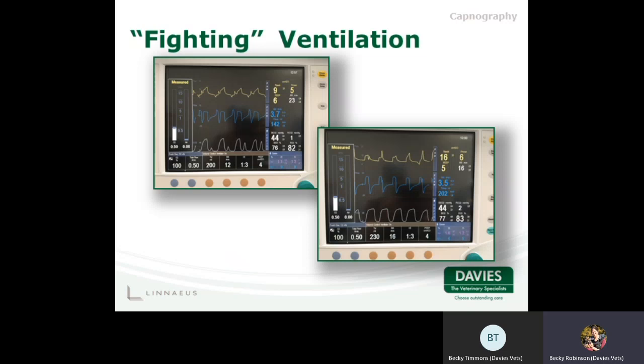We can see this in our capnograph trace because we now have nice, normal, even square waveforms. But also interestingly, we can see that the end-tidal carbon dioxide has not changed in either of these. It's still reading at 44 millimeters of mercury.